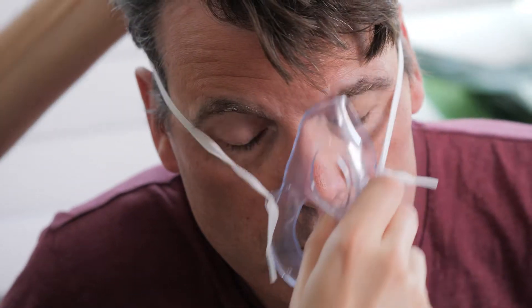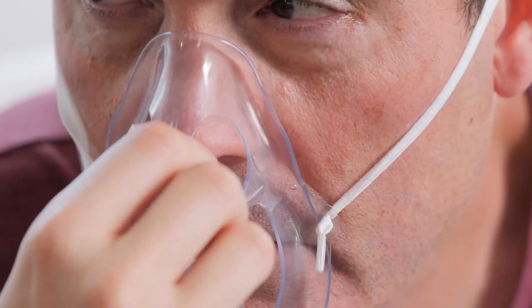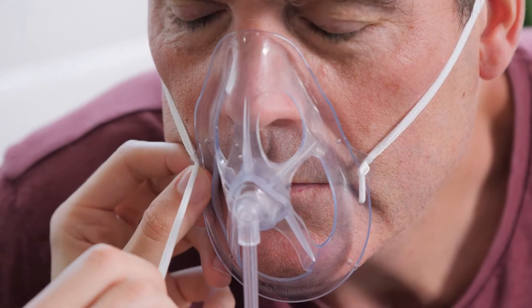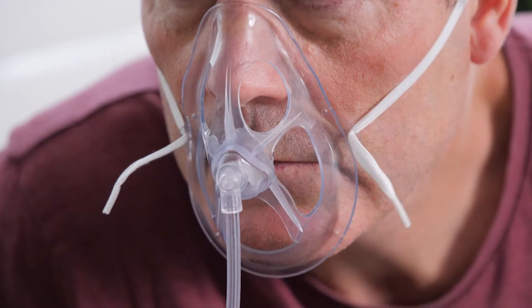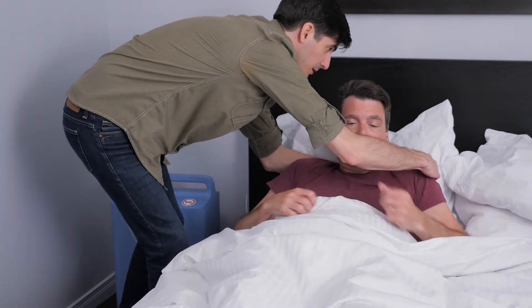You can also wrap a piece of gauze around the tube to make it more comfortable. If they use a mask, put the mask over their nose and mouth, then put the elastic strap behind their head. You can press the metal nose piece around their nose and adjust the elastic straps to make it more comfortable.